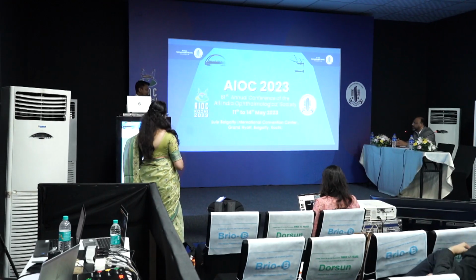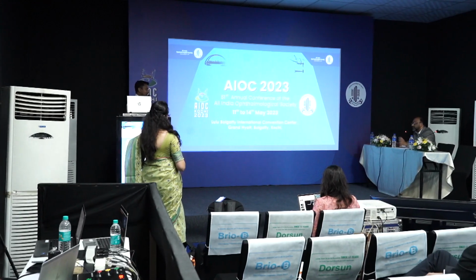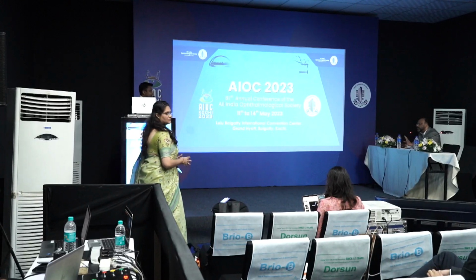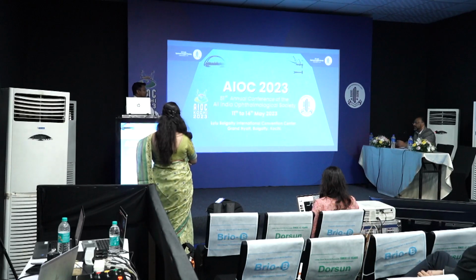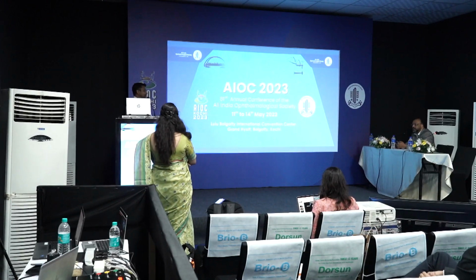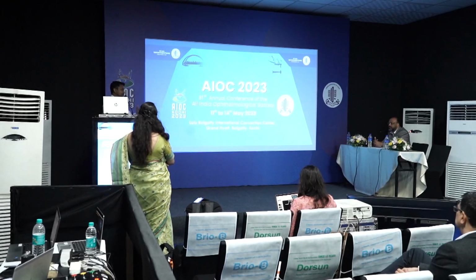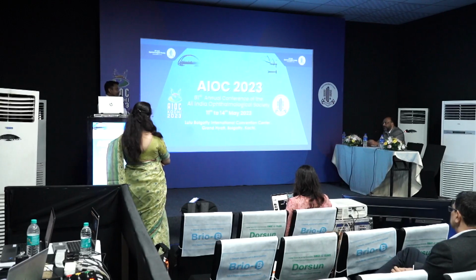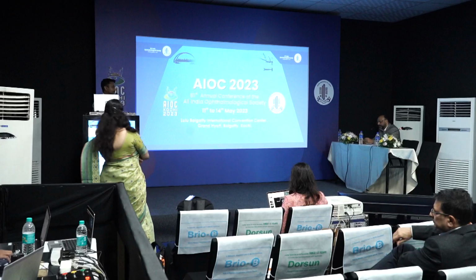Last question: at least in my experience, I find the tolerability where patients don't want to compare the eyes is about -1. Beyond that, if you make it 1.5 or 2, they somehow feel a significant drop in their satisfaction and vision. So I think -1 most people are able to tolerate. What is your experience? Exactly, sir. That's why monovision correction of more than -1.5, I think patients are not tolerating, because the stereopsis and contrast sensitivity all go down drastically. Yes, I would also agree with you. That's why the laser makes the target 0.89 diopters.